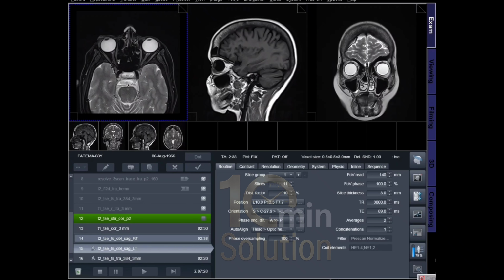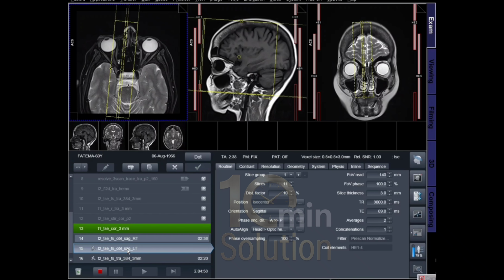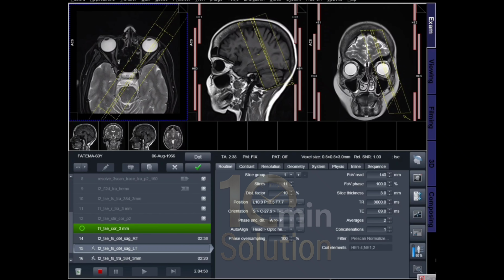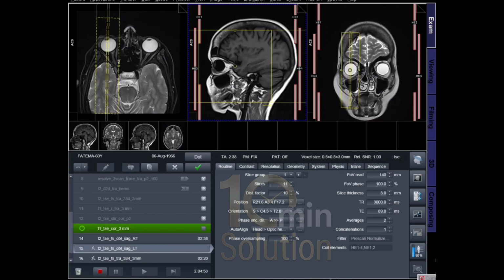You look here, now select the protocol and set up the plan, same way.